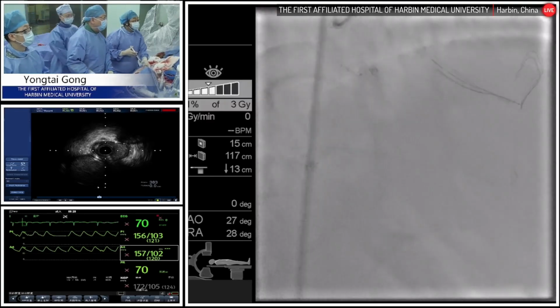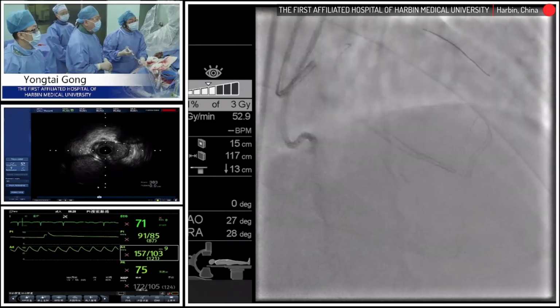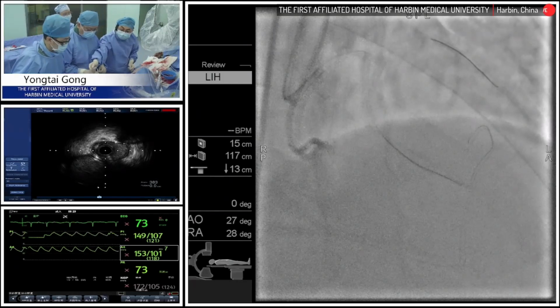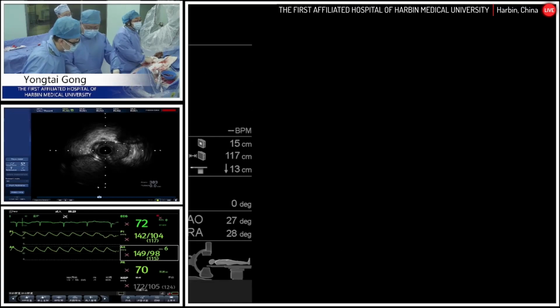So one thing is to identify the proximal cap location in cases with a blunt tip CTO segment, especially in this case. And we just made a pullback from the ramus branch to identify the proximal cap as well as its plaque composition and distribution.